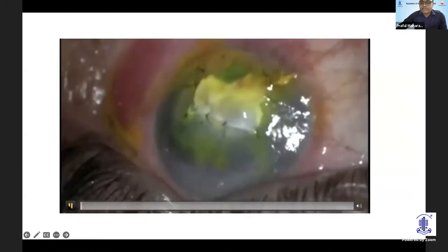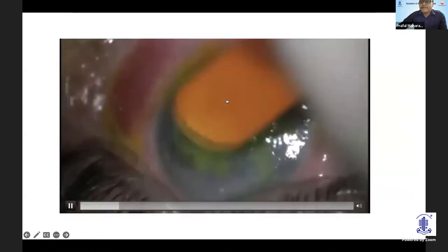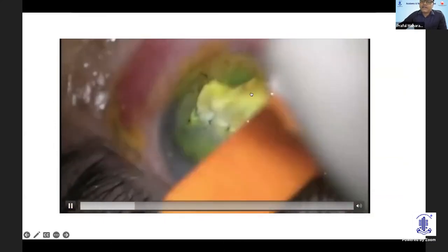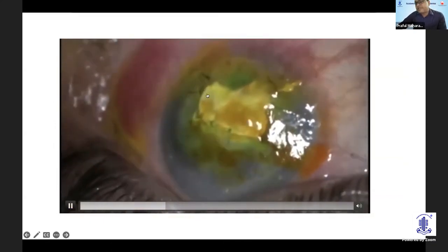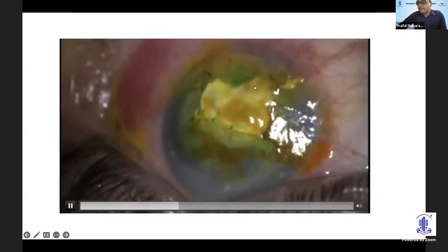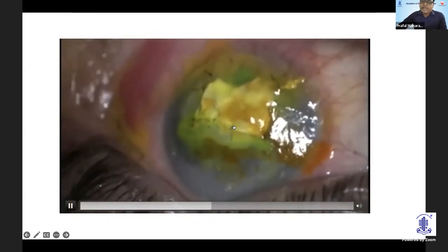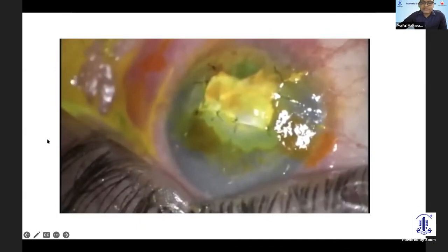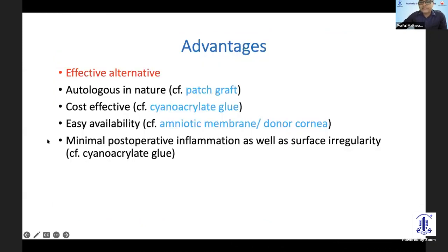This is a patient where next day there was a leak — you can see the graft retracted. The graft didn't have any tectonic strength; it was a slightly larger perforation and it was leaking from all around. In all these cases, tenon's has to be supplemented with some cyanoacrylate glue.